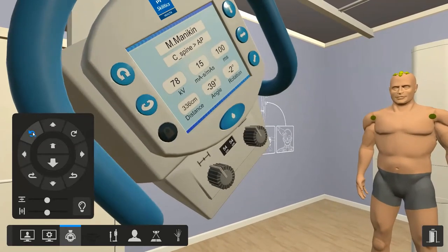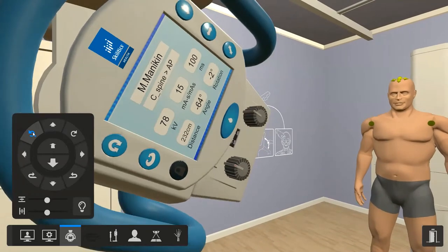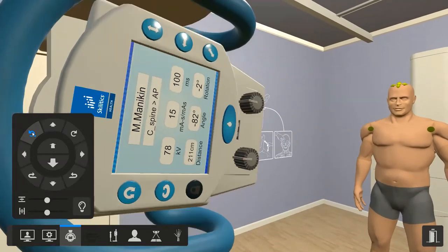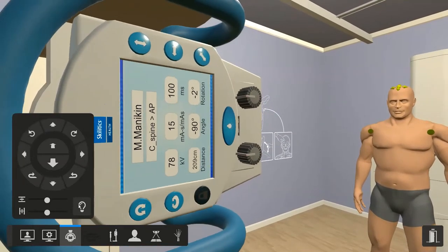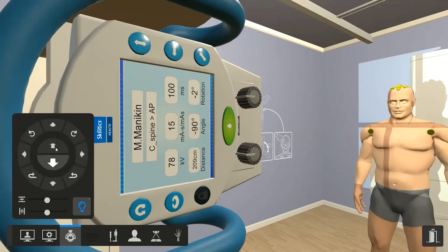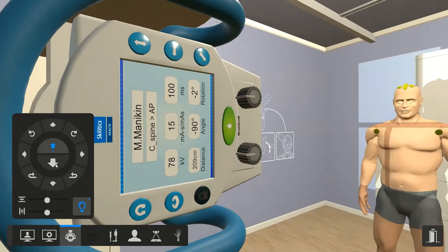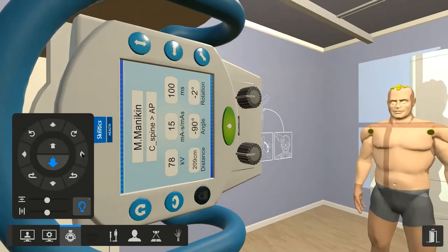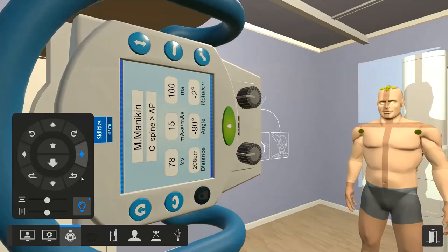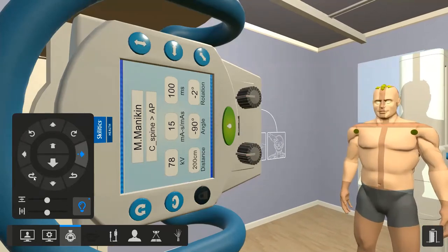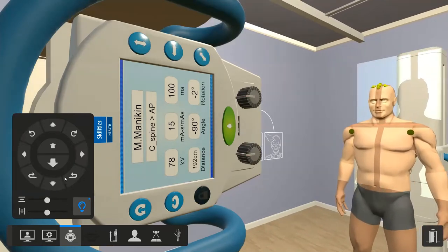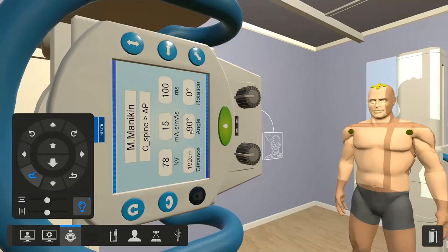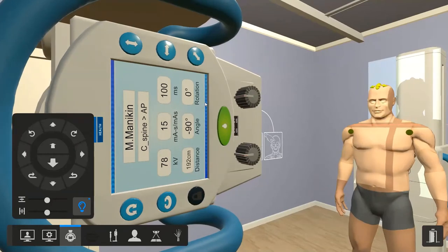We've got rotation here — we'll take that to 90 degrees. We've got our light, which we can turn on. We've got our directional arrows here. We've got the rotation, and we've taken that back to zero — so we've got 90, zero, and then we've got a distance, which I'll adjust in a couple of minutes.